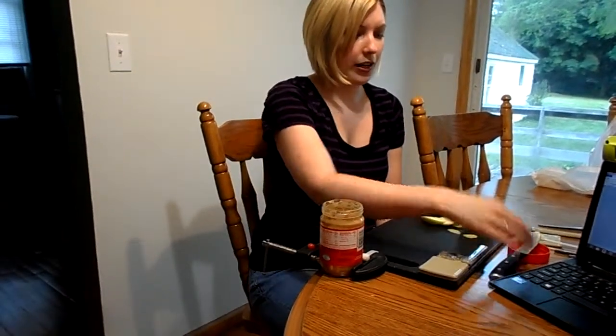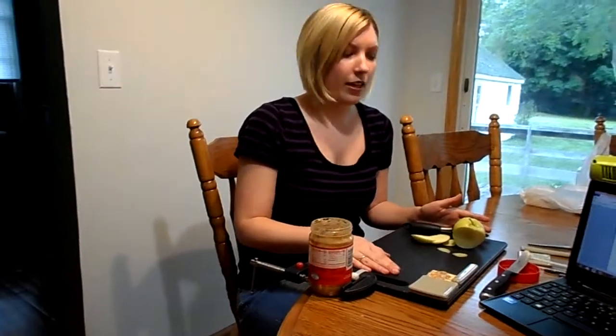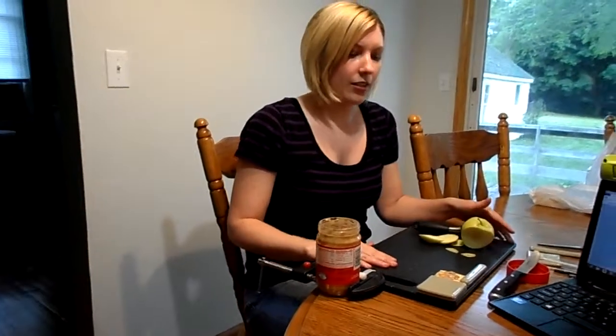So now I have just created a nutritious and delicious snack for myself. And I think this is a really great alternative to buying some of the more expensive cutting boards. This was only $23 to make, and I think it's a really great option and can help a lot of people. So I hope you enjoyed it.